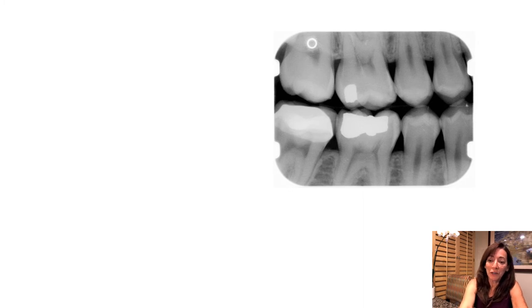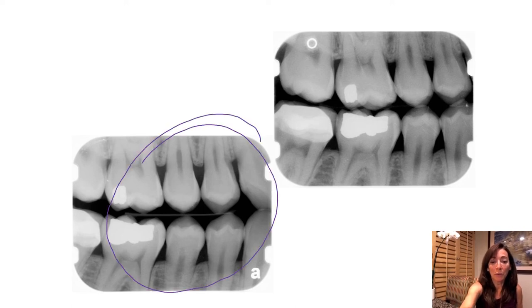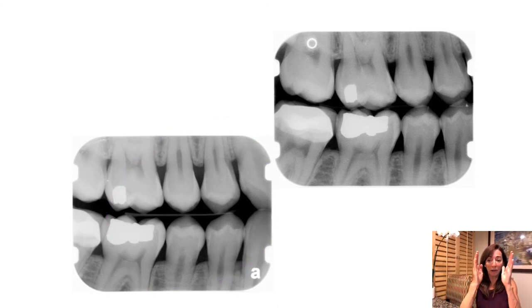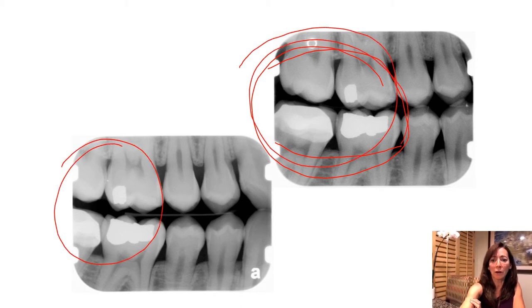Here's a different set of x-rays. You look at an x-ray and you think, hmm — is this a premolar image or is this a molar image? Well, it could be either, until we see the next one and compare them. Now this makes it all clear. As I talked about in my other video, the premolars were the star of the show when this image was taken — they were highlighting the premolars. So the premolars are going to go more toward the midline. This image clearly has a lot more molar in it; this one just has a little bit of molar.